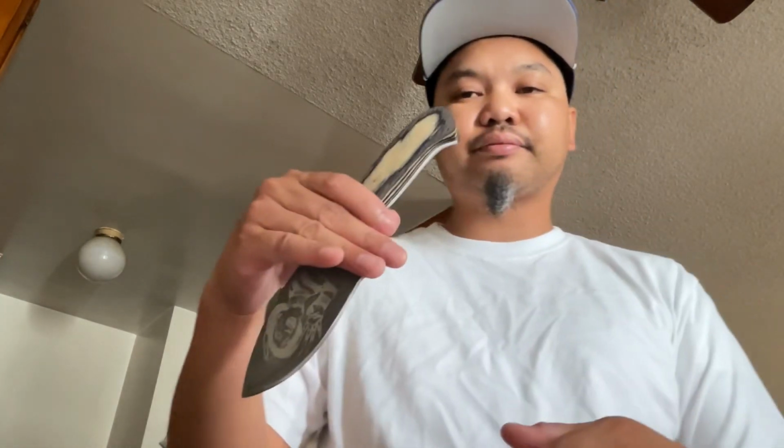So let's say I have a pneumatic drill. Let's just say this knife is a pneumatic drill. I will have my spray hose. Do not submerge it. If you can't see it, that means it's submerged. So basically keep it right above the water and just spray it down, on both sides. And then what you're going to do is get a wet cloth or a sponge, depending on whatever your hospital has available, soak it in the enzymatic, and then scrub it down.